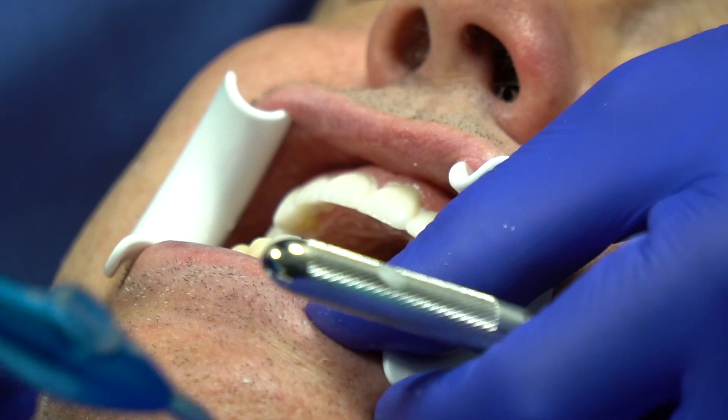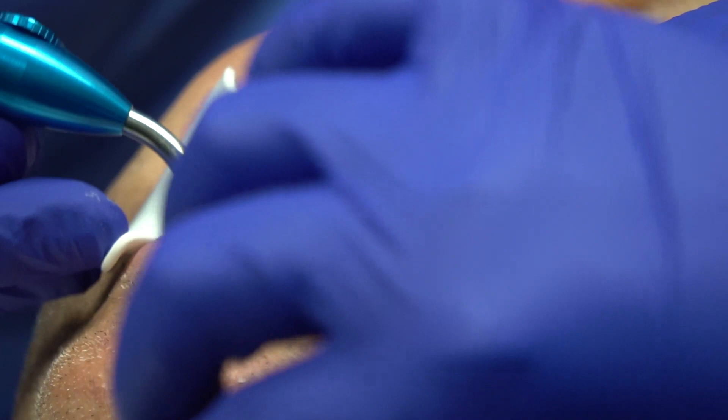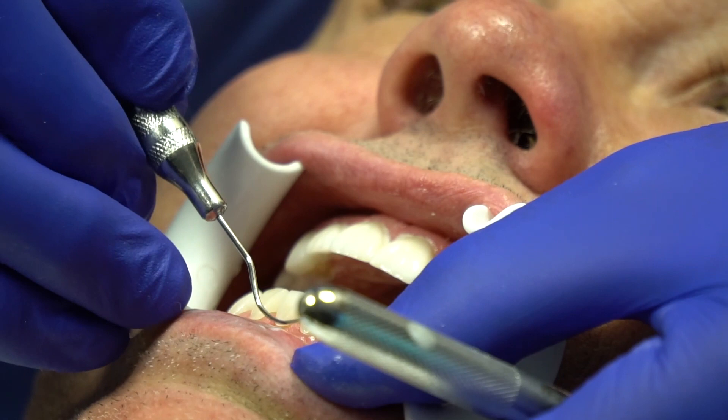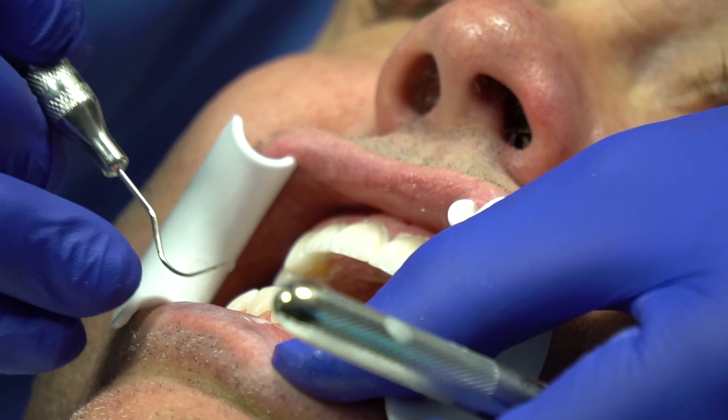I didn't prep a margin on the lowers — I just rounded out and went a little bit into the embrasures. These all line up great, but there's a little bit of a rock. If you seat it down on the incisal edge, they all go down beautifully. This one I may take just a hair off the incisal edge.